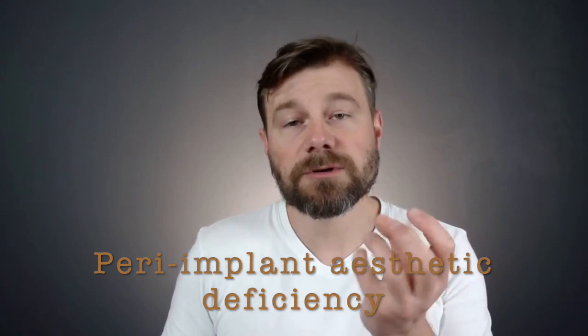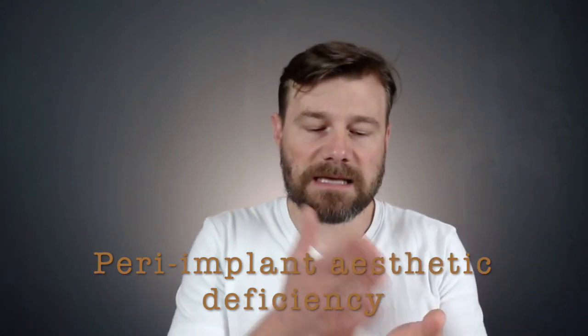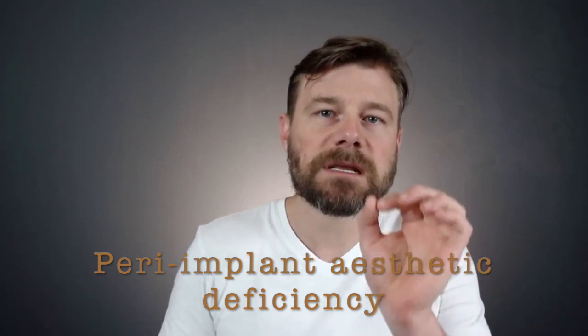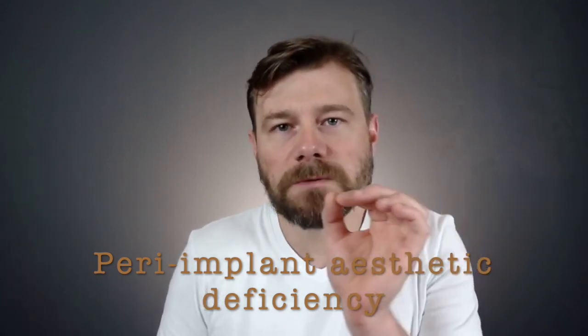We're going to choose some clinical cases as examples and go through them to show all the small tips, the small decisions behind the photographs, and the small movements that are impossible for us to show exactly in small movies or small pictures.